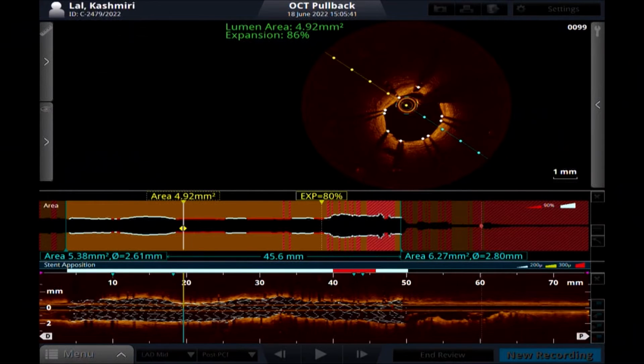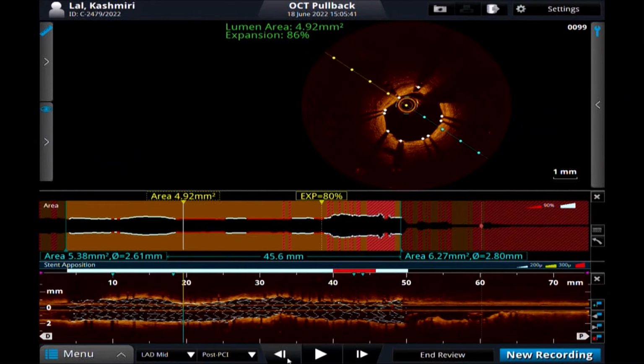If you do not have any problem, the plan is to open up now, one IVL, a 3.5 or 4 millimeter IVL here. You can try your IVL. No, do you feel like using the IVL now, when we have achieved a good area? Let me try to open it up with the NC balloon instead of going for the IVL. In case we are able to achieve a good area with the NC balloon, I think we are okay to go at 4. Sir, I think any chance of NC balloon perforation here? NC balloon perforation? NC 4 millimeter balloon or 3.75.